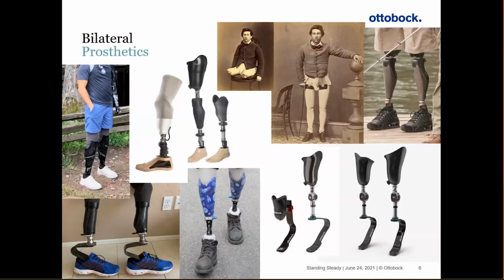As you're thinking about building the prosthesis, what components are available, you see in the upper middle section some historical photos. We've really come a long way with microprocessor knee technology and really seen that advancement from wheelchairs to walking with the new technology that's available.